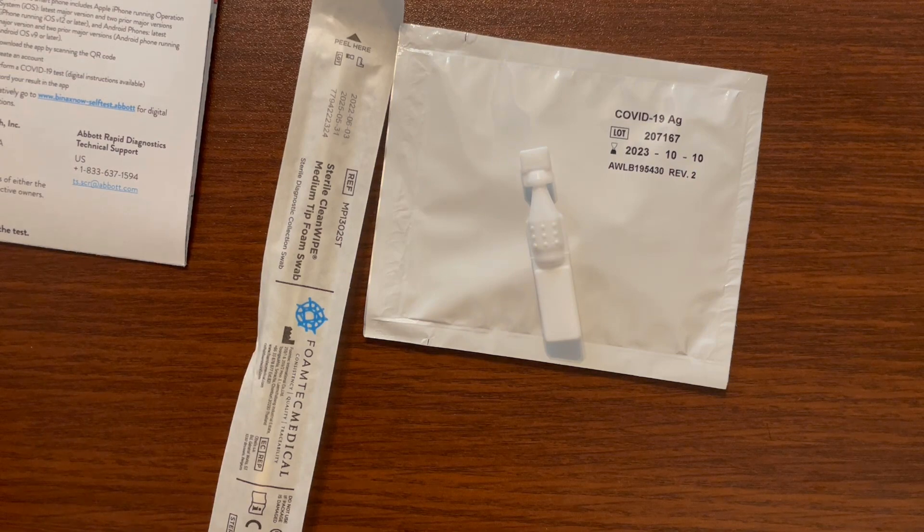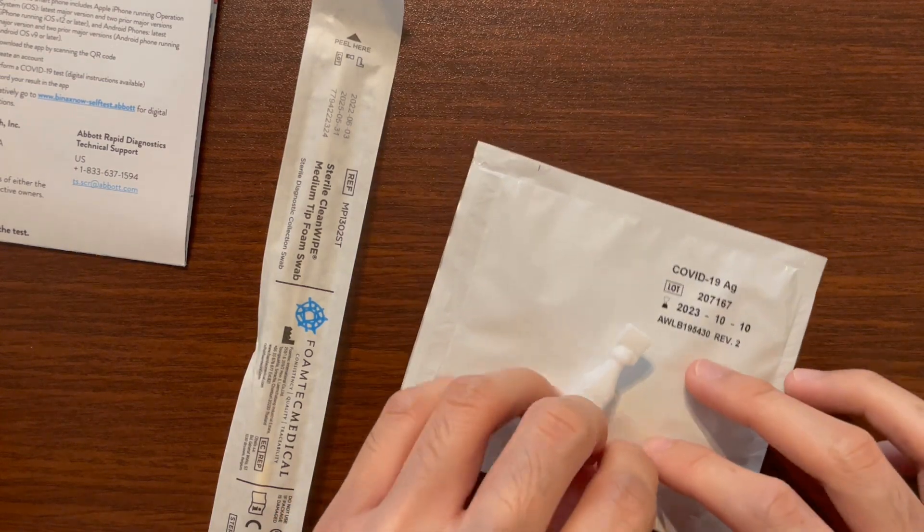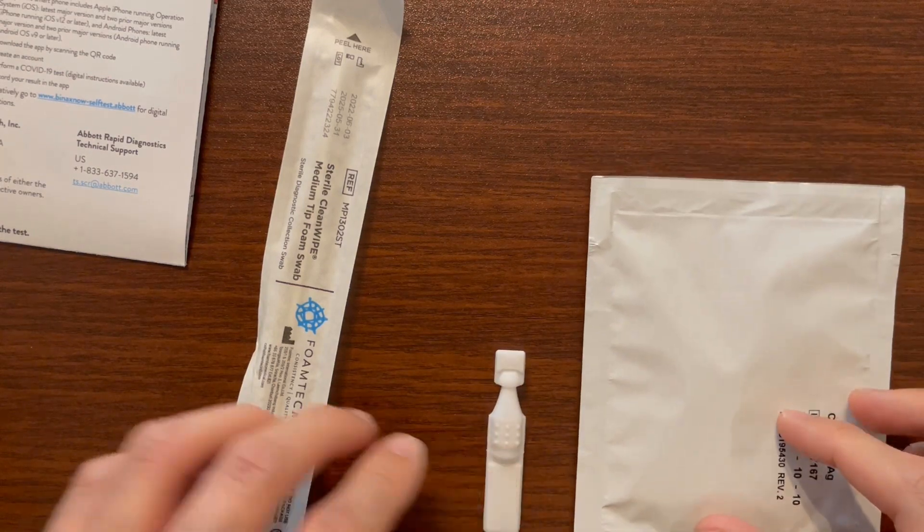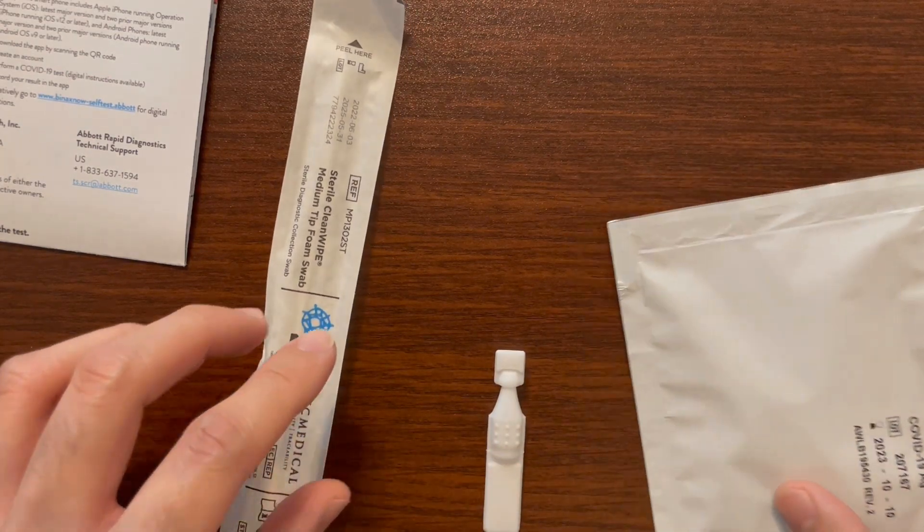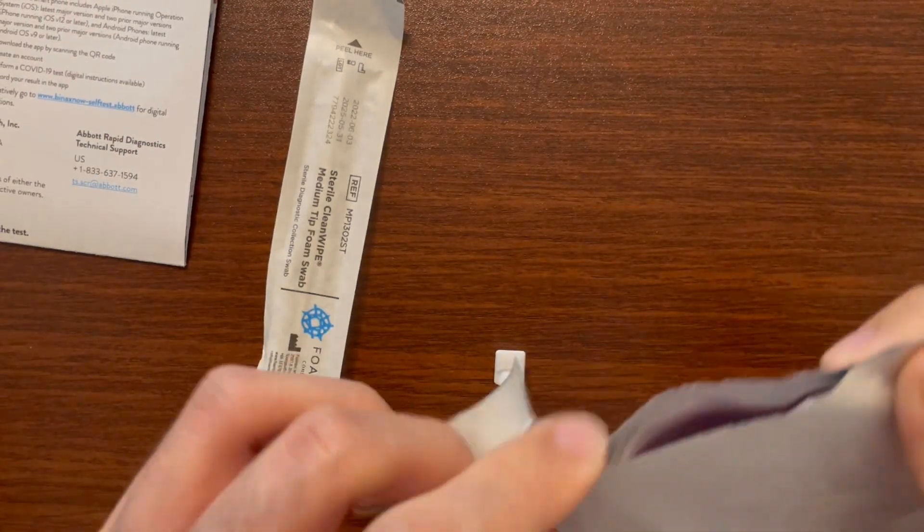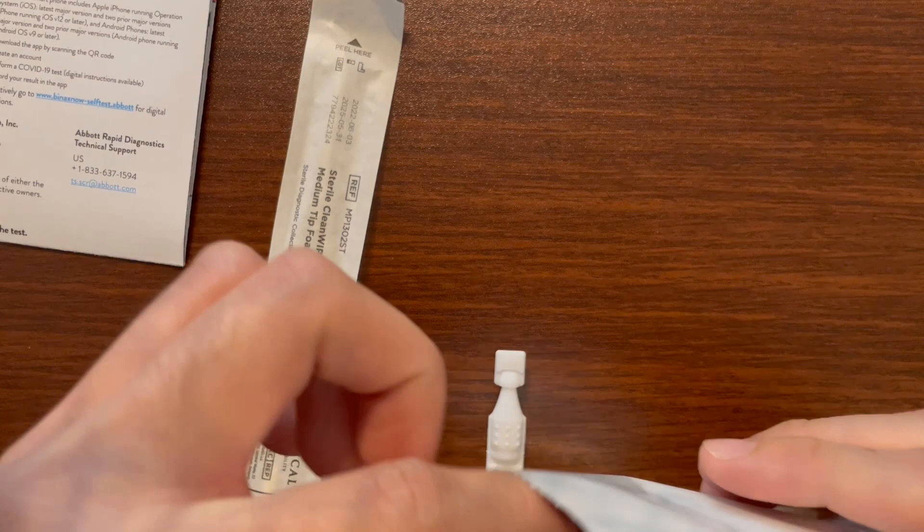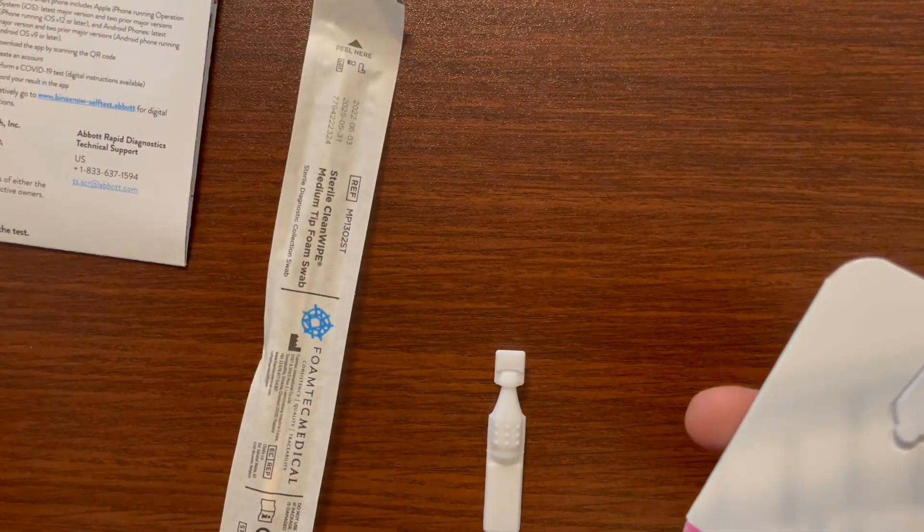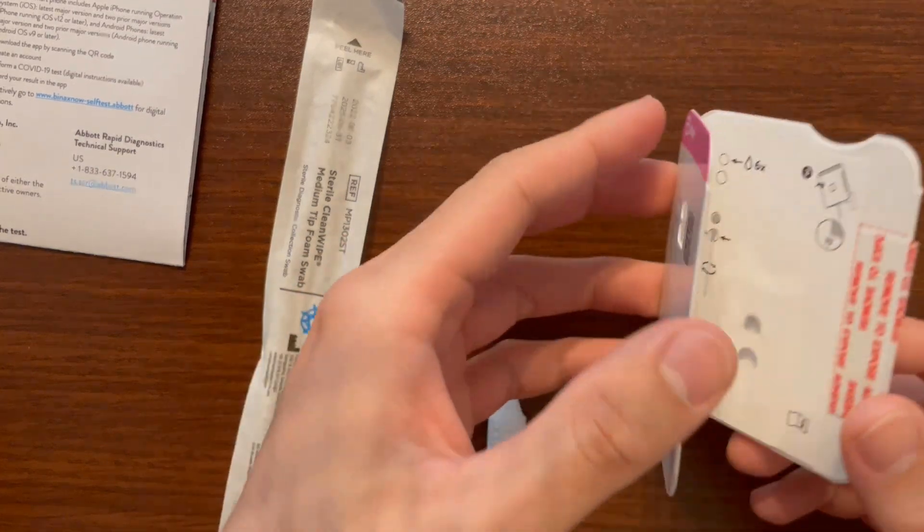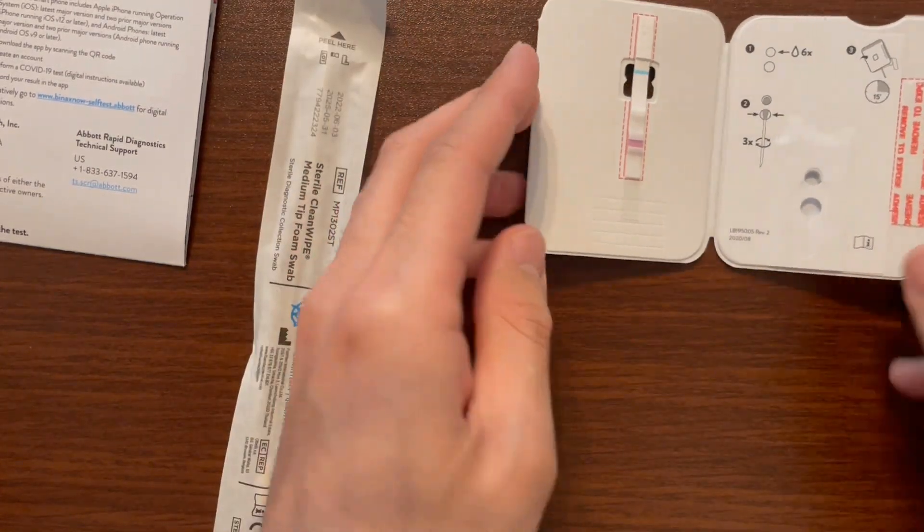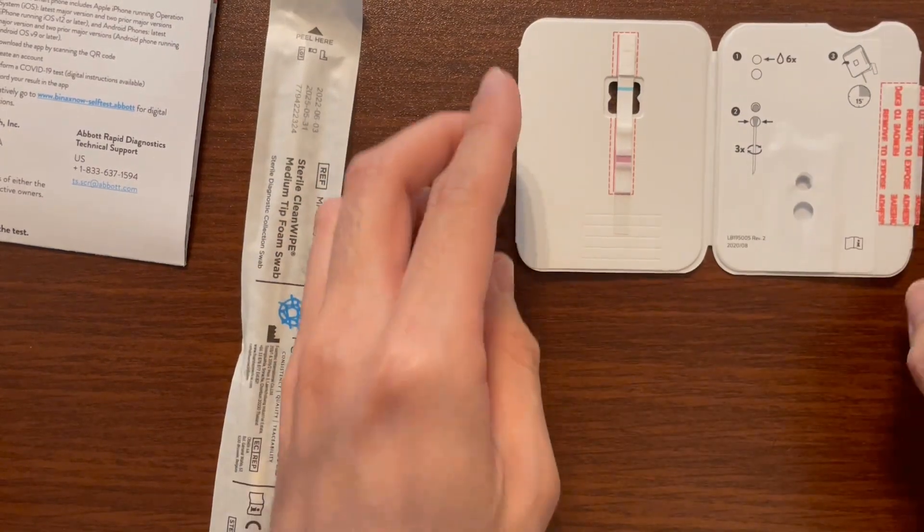The first thing you're going to want to do is wash your hands and make sure that they're dry. We're going to start by removing the test card from the pouch. Take out this test card, set aside the pouch, and open it without touching any of the inside, then lay it flat on the table.